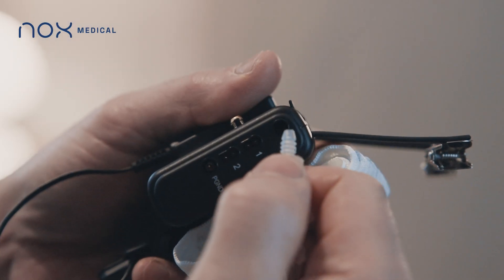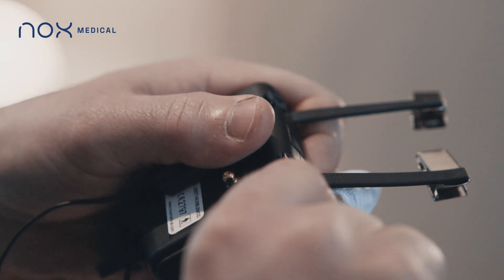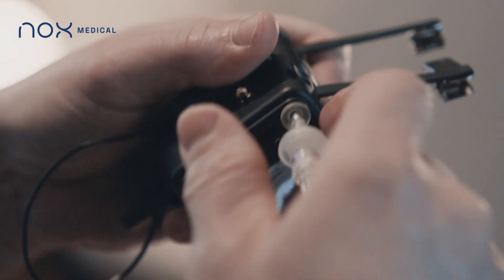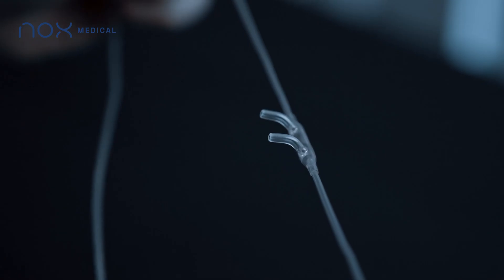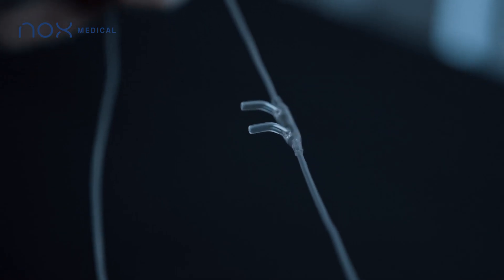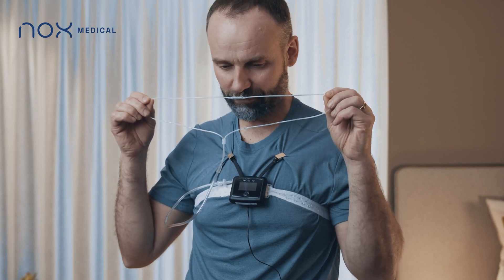The nasal cannula is connected by pressing the end into the pressure input on the Nox T3 device. Take the end with the prongs, make sure they face downwards, and place the prongs gently into your nostrils.